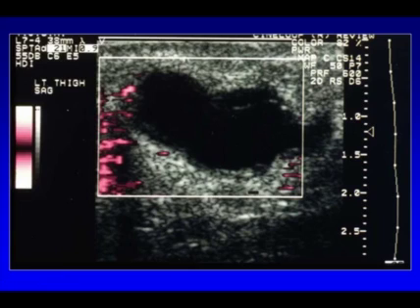So we felt with the history of melanoma, we were obligated to at least stick a needle in this and send it for cytology. And we were able to drain this out completely. Cytology was negative, and this was a postoperative seroma in the inguinal region.